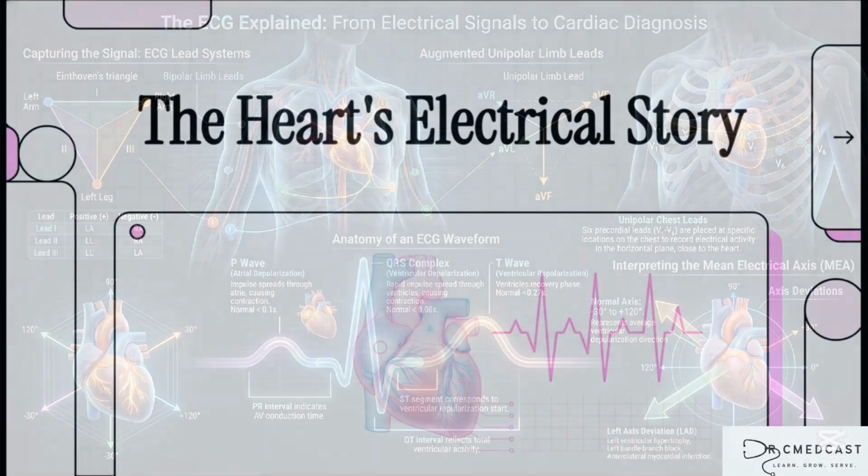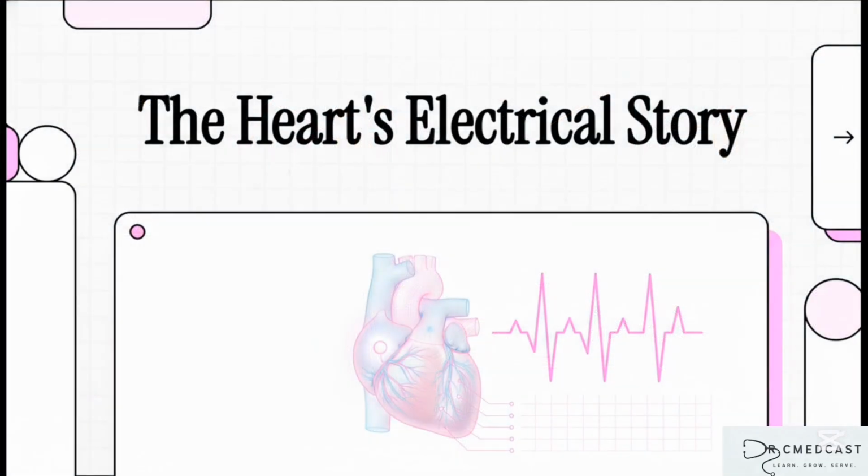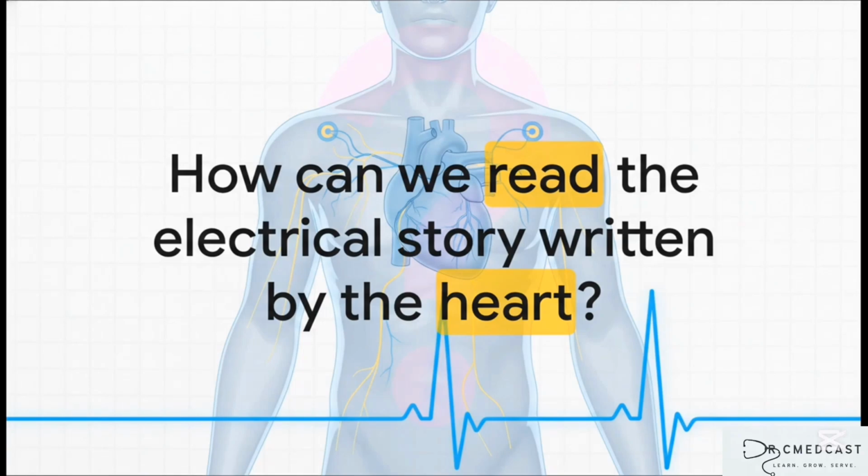In today's session, we're going to explore one of medicine's most fundamental tools, the electrocardiogram. We're going to learn how to read the incredibly detailed electrical story the heart tells us, beat by beat. So that really is the core question, isn't it? The heart communicates in this language of electricity. It's like a silent story of its own health and function. And our job is to learn how to read that story, just by looking at what's happening on the surface of the skin.